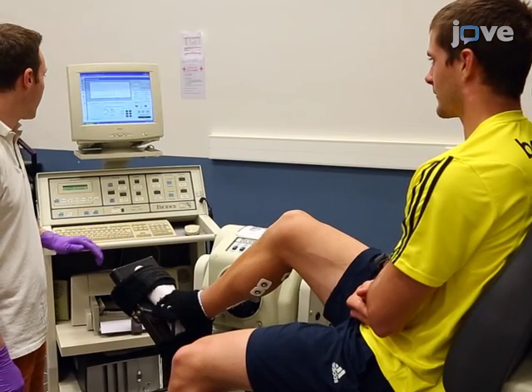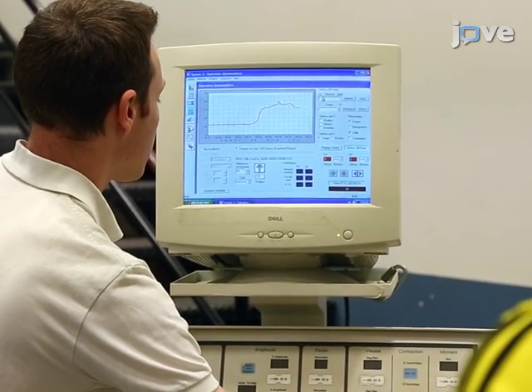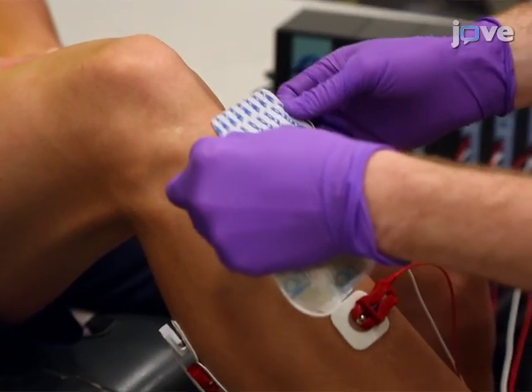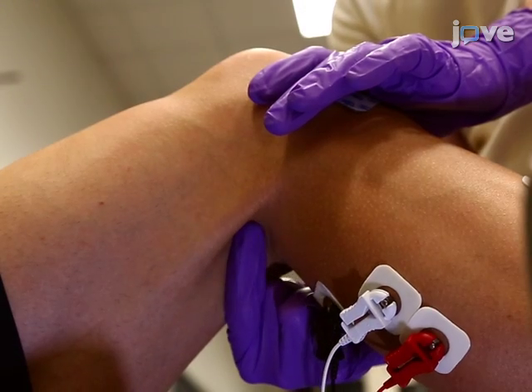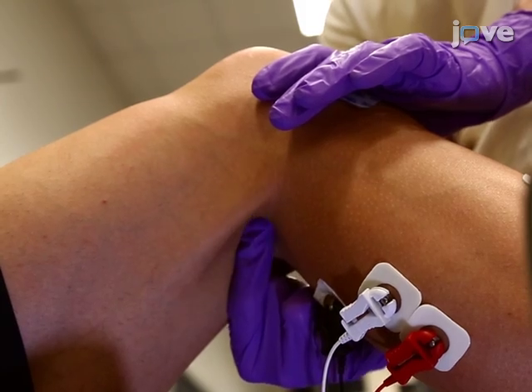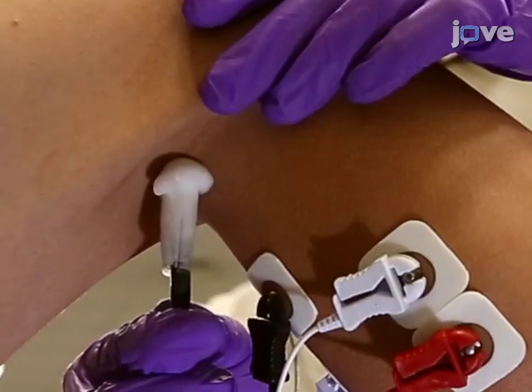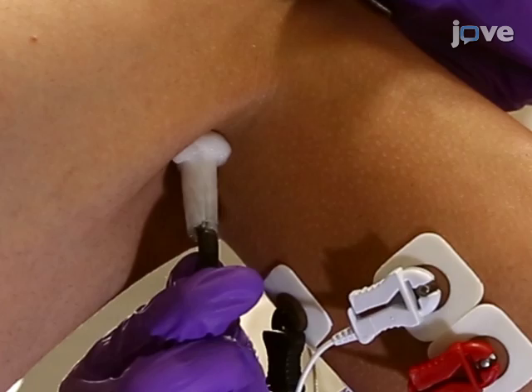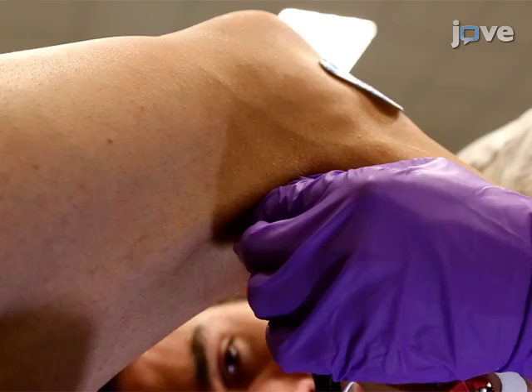Ask the participant to exert pressure on a footplate and record the plantar flexor torque. Then connect the electrodes to the amplifier and place the anode for electrical stimulation over the patellar tendon. Try to feel the posterior tibial nerve through the skin in the popliteal fossa, then determine the best stimulation site. Use a handheld cathode ball electrode on the popliteal fossa to find the site with the largest H-reflex. At that location, attach the self-adhesive silver chloride cathode.